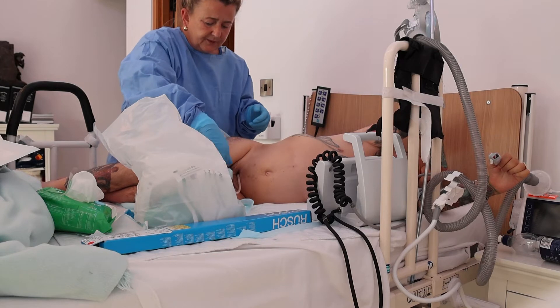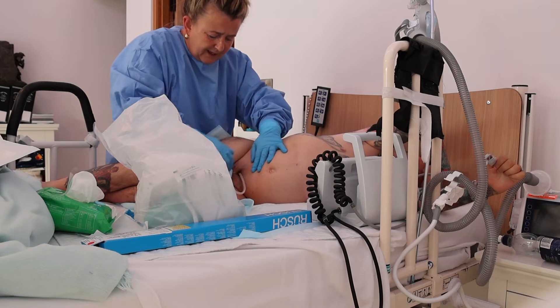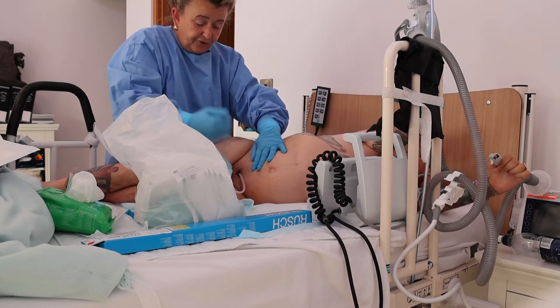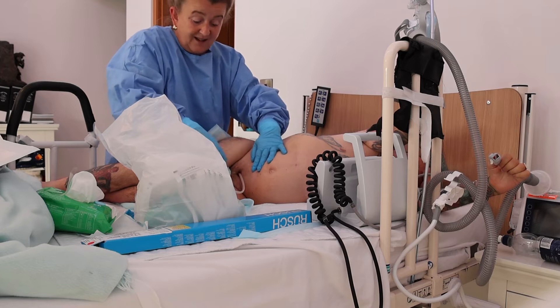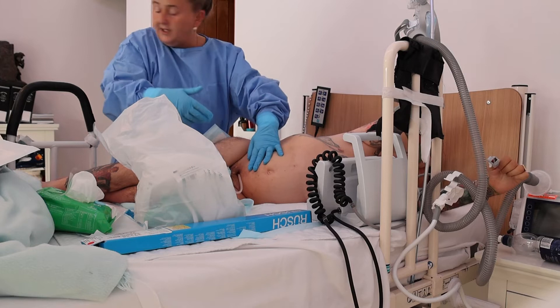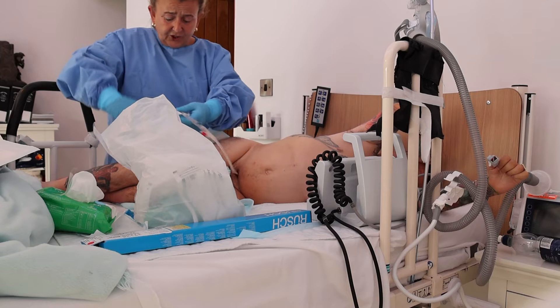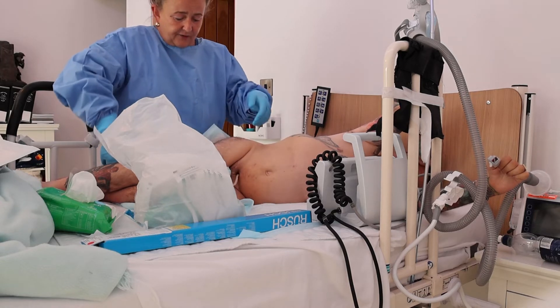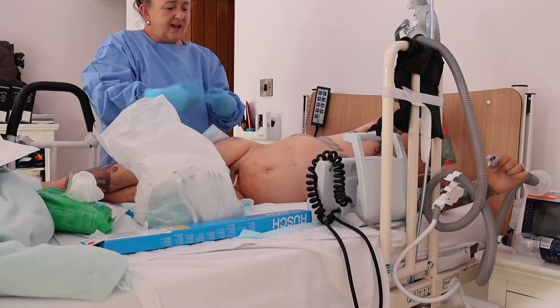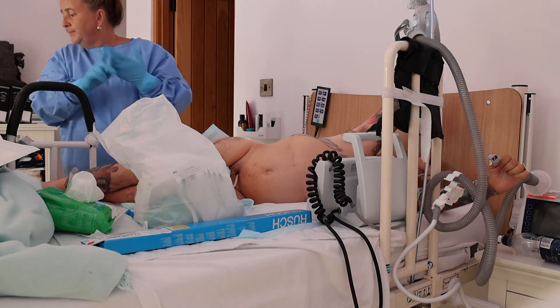As you can see, here's the stoma — it's been very bloody and has overgranulation. The tube itself, to my naked eye, does look like it's got blood in it. I'm going to give him antibiotics when we get him up. I'm going to go fully straight in now and get this out of him because he doesn't want to be the way he is, and we've done every possible step. I've got bladder wash and everything ready.